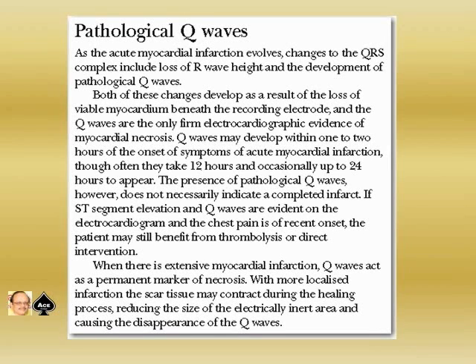The presence of a pathological Q wave, however, does not necessarily indicate a completed infarct. If ST segment elevation and Q waves are evident on the electrocardiogram and the chest pain is of recent onset, the patient may still benefit from thrombolysis or direct intervention. When there is extensive myocardial infarction, Q waves act as a permanent marker of necrosis.